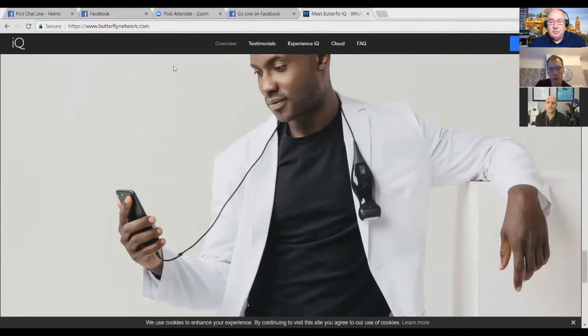I think the really important thing to bear in mind with any of these things is make sure it's fit for purpose as to what you're going to use it for. Particularly for podiatrists, it ideally needs to have a reasonable range in terms of resolution. You're going to be looking at stuff that's quite superficial. You're also going to want a good Doppler function on it, particularly for some of the joints and things you're going to be evaluating. You want to be able to pick up any blood flow in it, if there's any synovitis, et cetera.